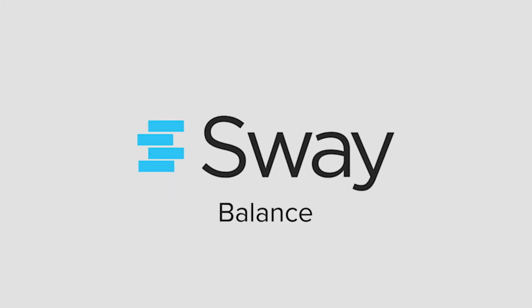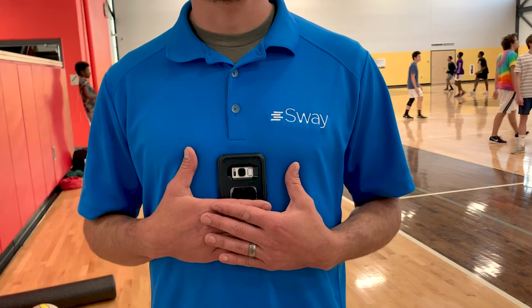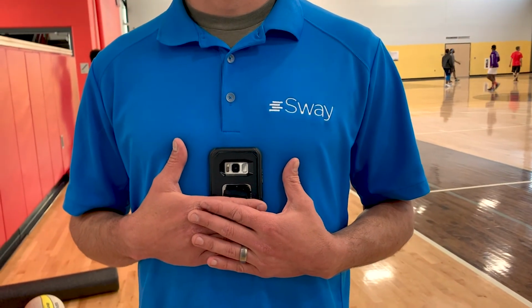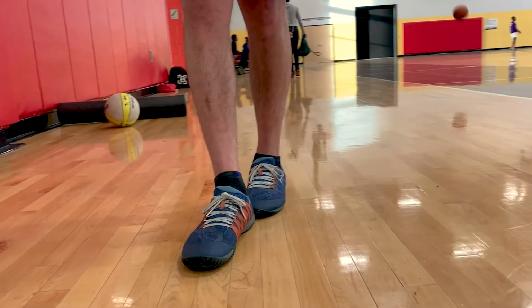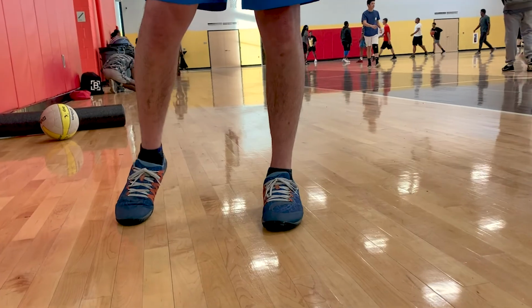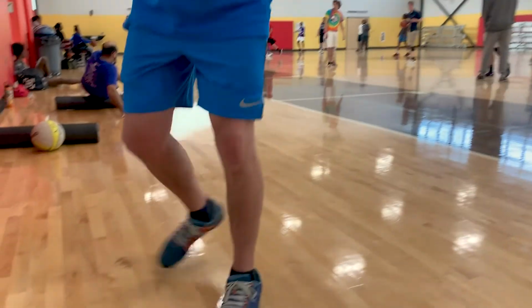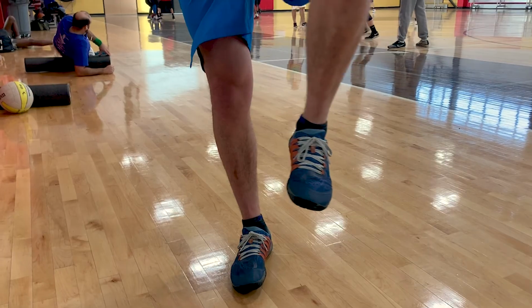To administer a balance test, first remind your athletes to pay attention to any left or right foot specific instruction. Instruct the subject to firmly press the phone against their chest with both hands with the screen of the phone facing their chest. Remind the athlete to make sure their feet are toe to heel in a straight line during the tandem stance, and if they become unstable, to quickly step to the side and regain the balanced position required for the testing. Remind the athlete if they become unstable during a single leg stance to quickly step down and regain the balanced position required for that test.